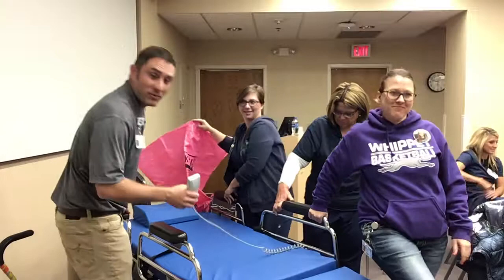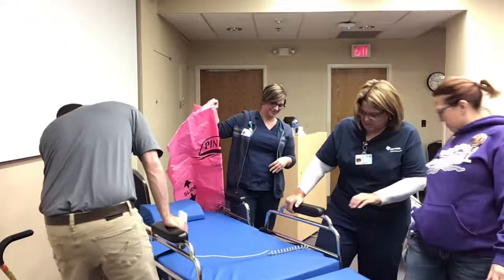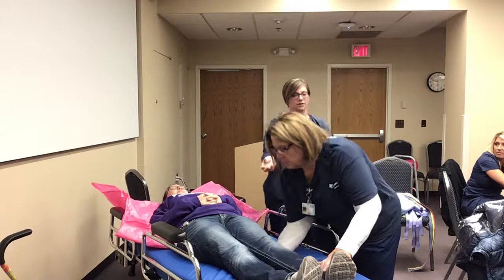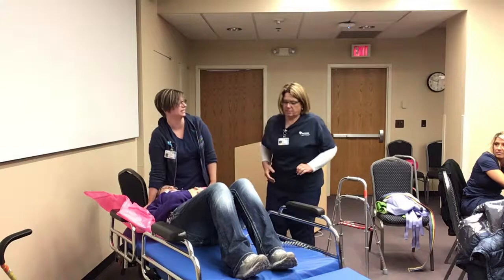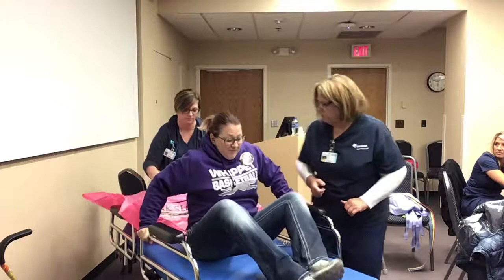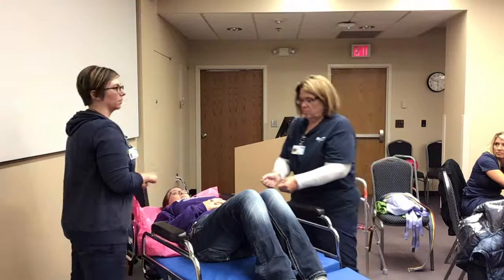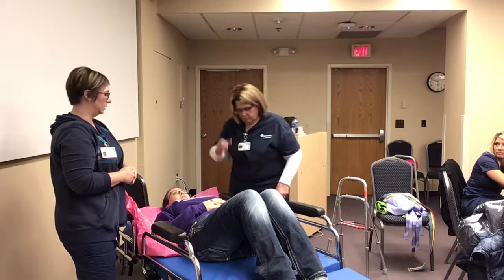Set the brakes, everybody. If your patient is unable to boost themselves, you can take a draw sheet and put it right underneath their legs. Then two of you, at the same time, just step forward — and that patient will slide right up the bed. So there it is: you don't have to lift. It's pretty slick.